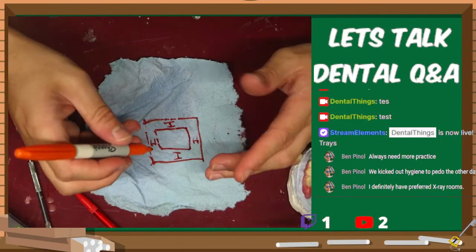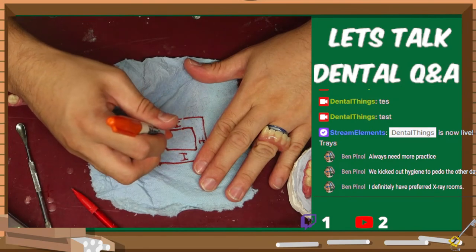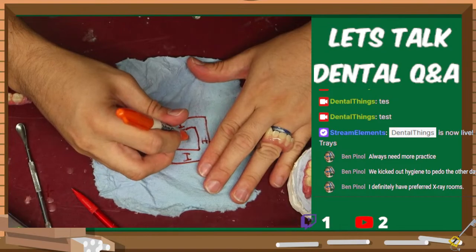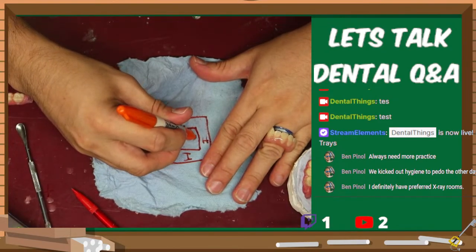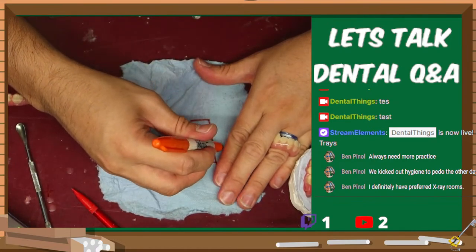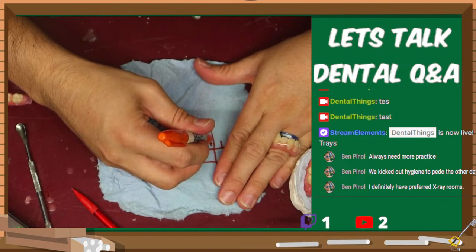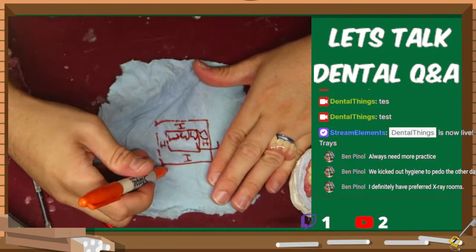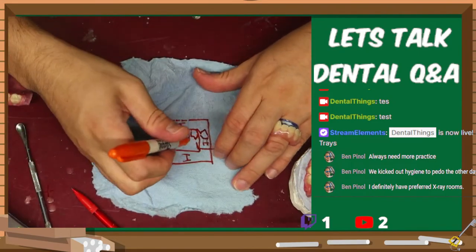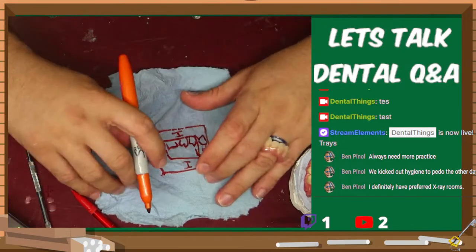If I was to try to take an X-ray right there, I'll probably get a molar, which is fine and dandy. I'll probably get another molar in here, and then one premolar, and then I'm missing the other one. If only I had this extra space over here on this side to use, I could probably get my other premolar and call it a day. But manufacturers make it all stupid, and the only usable area is the center square, and we have all this extra room on the outside.